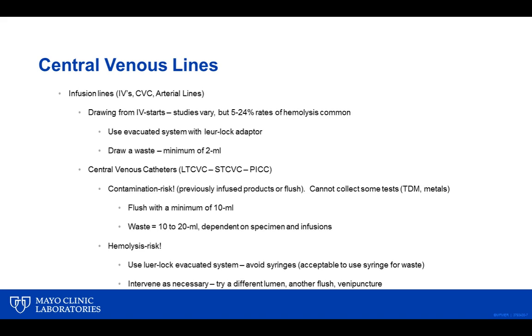We know that this presentation is focused primarily on difficult collections. But those of you that are involved with lines, even though they're not a venipuncture, there's still some things to be watchful of, especially if you're present during the collection. That's to assure that we draw sufficient waste to avoid any potential contamination, and also to monitor the actual collection process when the nurse draws the specimen.